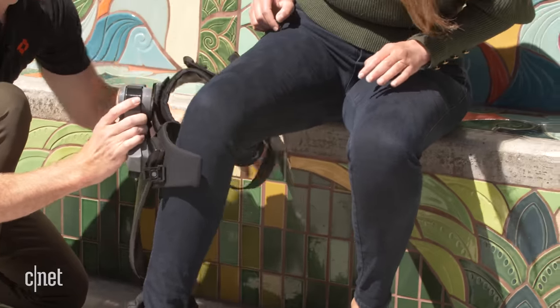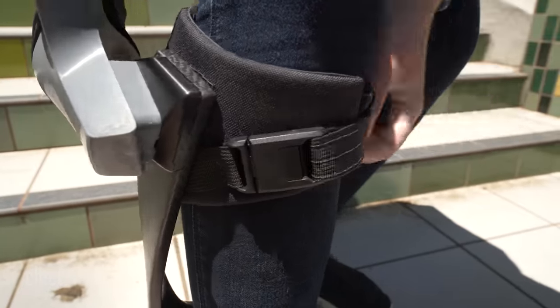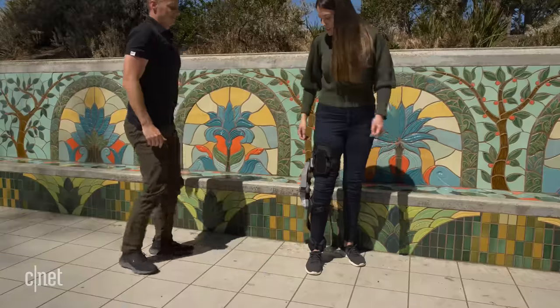Now it's time to try it on. I'll be wearing a demo unit that's fit to me, but the actual Ascend is made to each wearer's specific limb measurements and weighs about two and a half pounds.